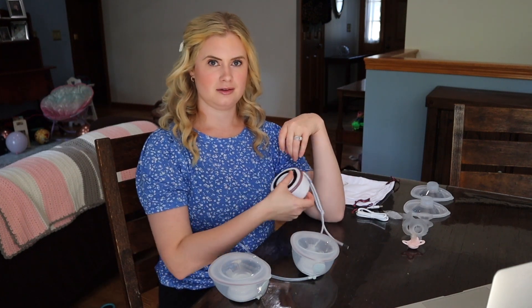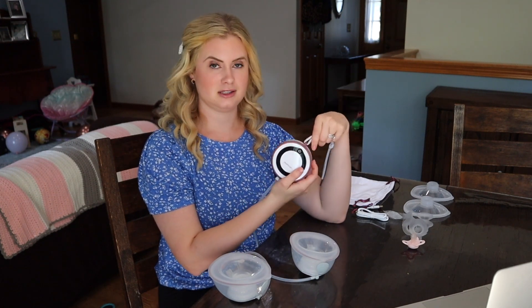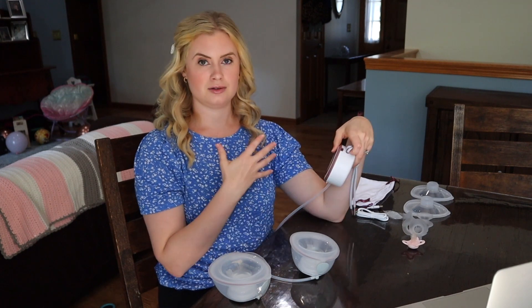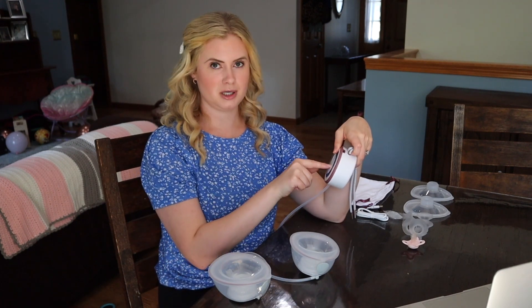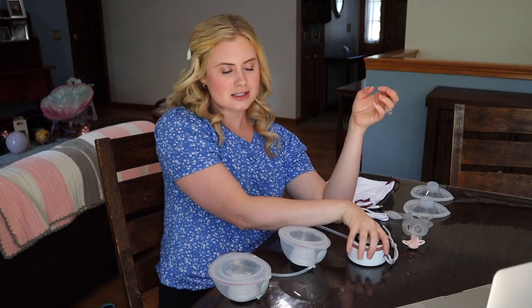You can have this hooked to something, in your purse, hanging off your pants — whatever — and just adjust your levels without sticking your hand in your shirt. With typical wearables you have to open it up and do that one pump at a time. So that's just another plus.